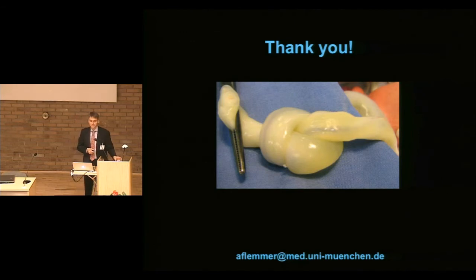Thank you. What do you think about ultrasound as a technique for detection of air leak syndromes, or another pathology in the lungs of the newborns? So lung ultrasound, of course, is difficult. It is a very good tool if you have pleural effusion. It has also been shown to be a sufficient tool to detect endotracheal tube position, actually. And I have no experience with regard to air leak as a diagnostic tool. It might be used. I'm not aware of any studies there.